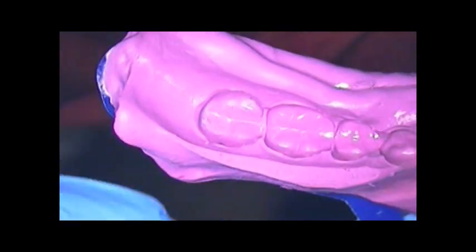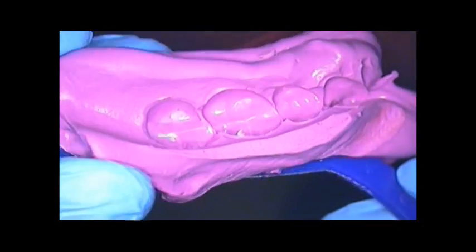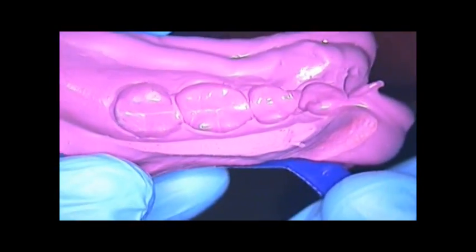Again, the alginate will be dual poured after we're complete with our treatment. So I'll cement the temporary and then instruct either myself to go back and pour it, or my lab assistant will pour it. And snapstone sets very, very quickly. And about 30 seconds to go here.